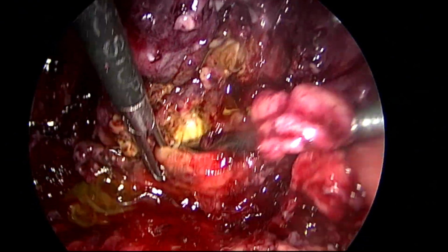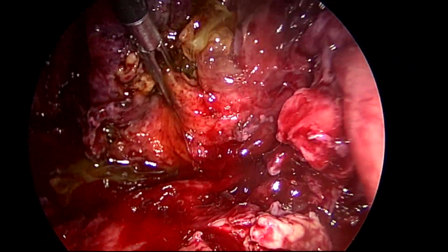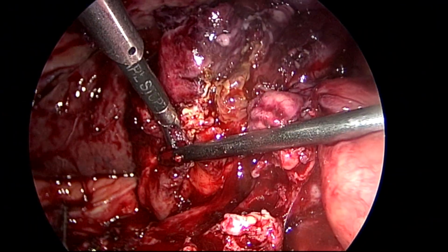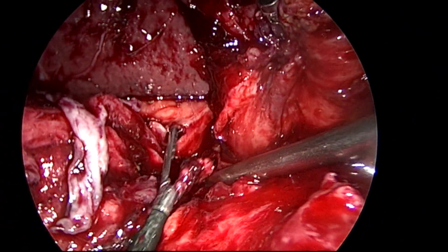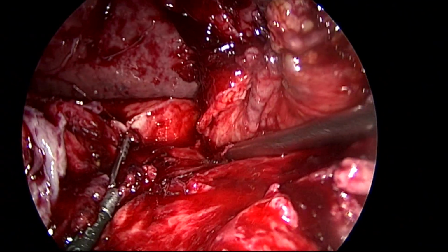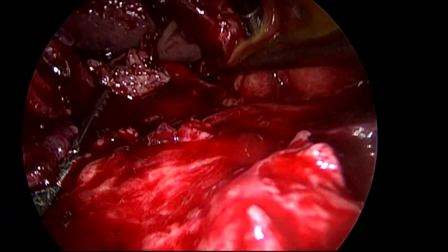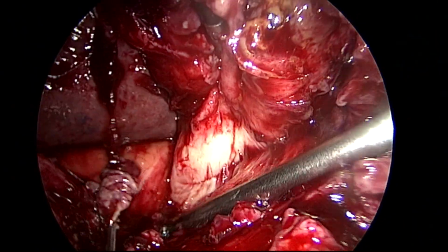So, now I am going. I cleared the gallbladder content, I am just aspirating the content. Now, I am going down. I have to identify the infundibulum, then only I can reach the Calot's triangle. My aim is not to dissect the anterior Calot's to identify the cystic duct and artery. My aim is to identify the infundibulum of the gallbladder. See, now you can see the infundibulum is coming out.